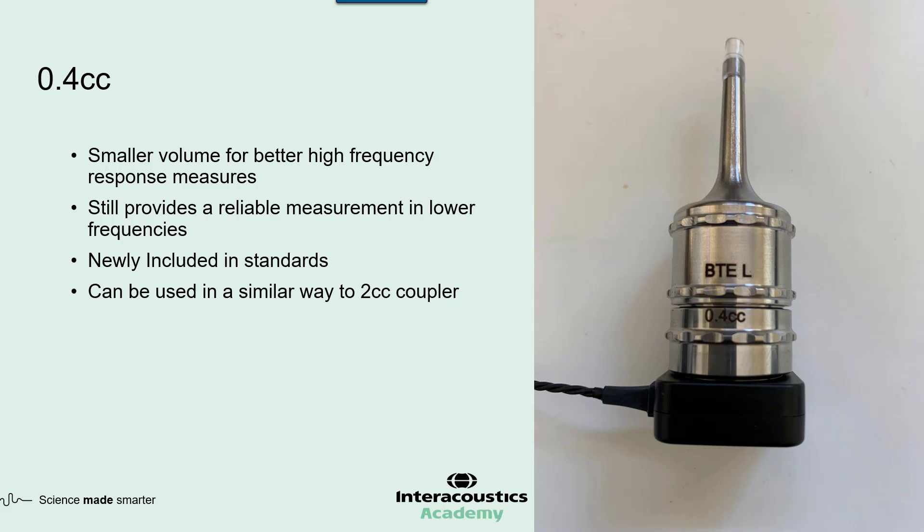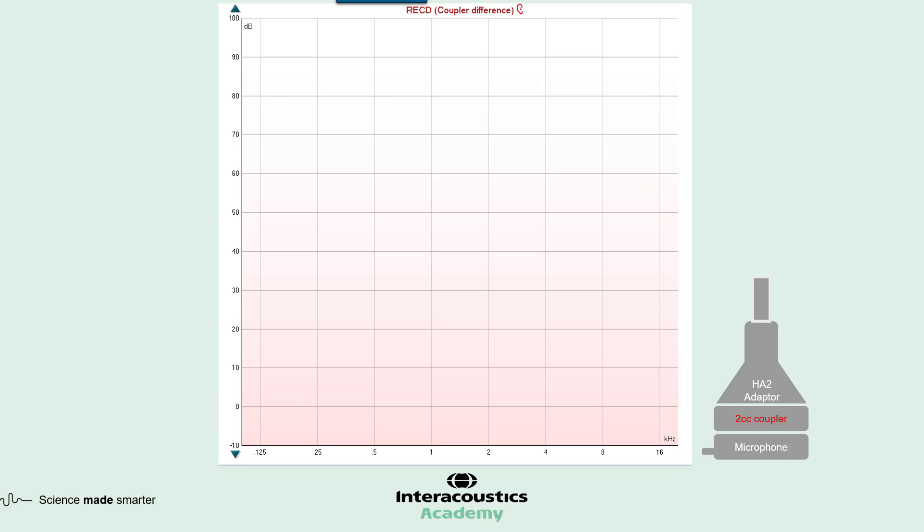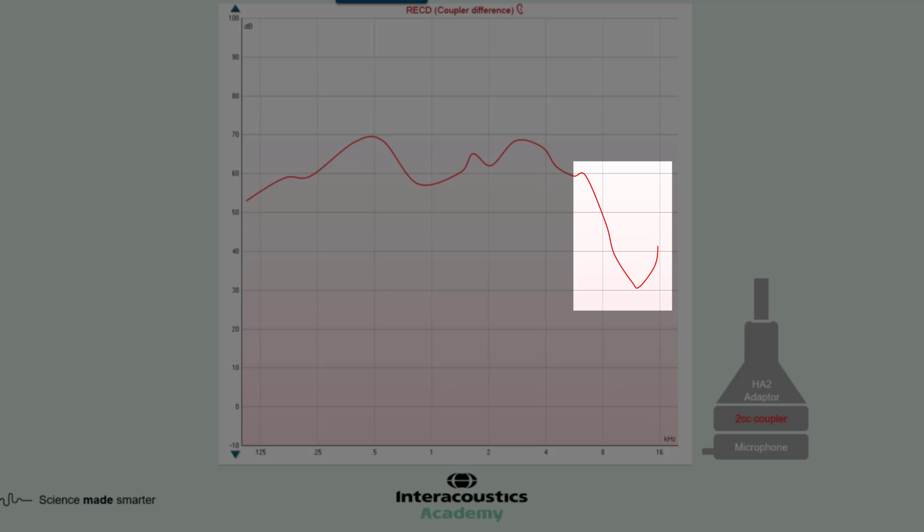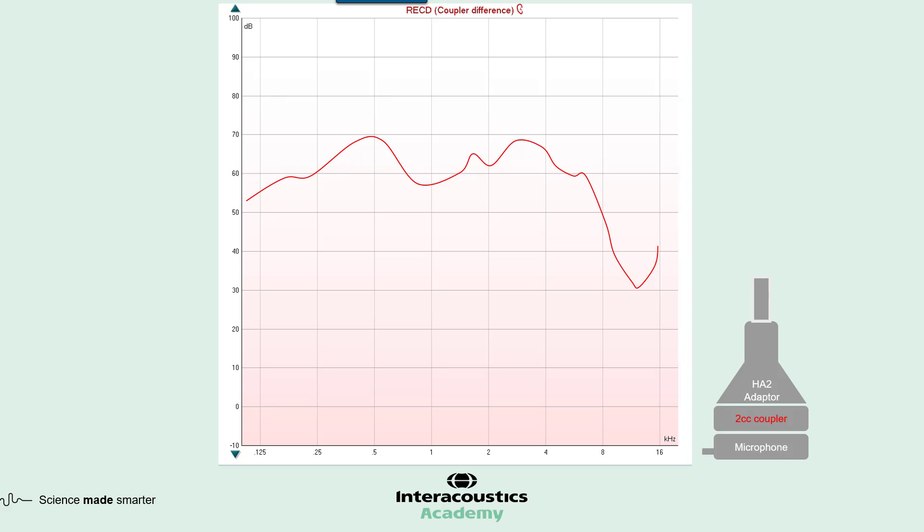Let's look at how these different couplers perform in relation to a sweep stimulus — the only difference between the measurements I'll show is the coupler used. Here's the frequency response of a 2 cc coupler. You'll notice good stability in the lower and mid frequencies; however, when we get into higher frequencies and specifically above 8 kHz, you'll notice a drop in performance. This drop is due to standing waves, which we'll discuss in a moment.